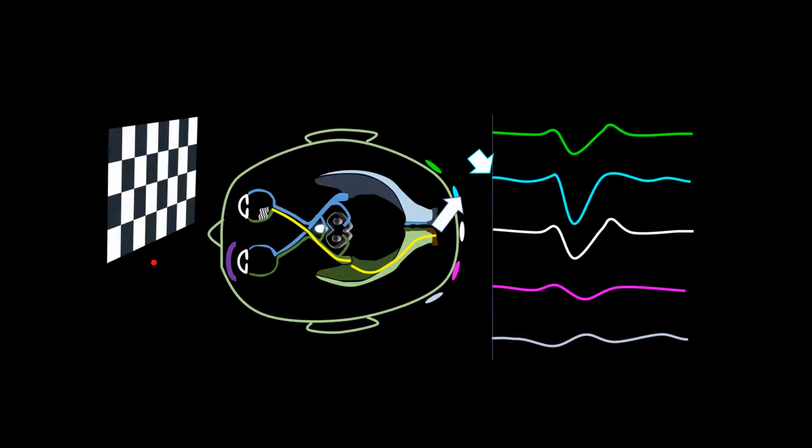I will provide you with an example. At the right lateral occipital electrode, we see the N75 that is also present at the right temporal electrode in green and at the occipital sagittal electrode in white. This coincides with the P75 recorded at the left temporal electrode.